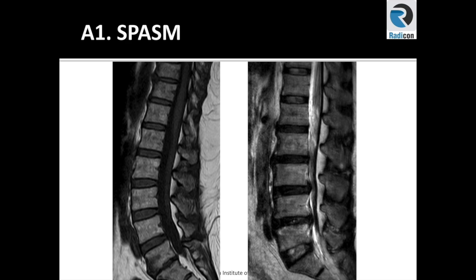Let's look at spasm. Spasm causes straightening of the lumbar spine and is a very common finding — but how do you report it? There is a very simple way. If a straight line crosses through the middle of four consecutive vertebral bodies, then report it as a straightened, spasmodic lower back, as seen on the right side. In a normal lordotic lumbar spine, such as the one on the left side, four consecutive lumbar bodies almost never follow a straight line.